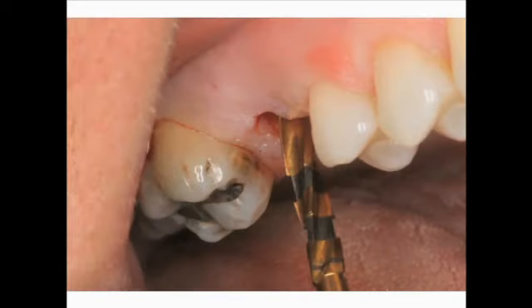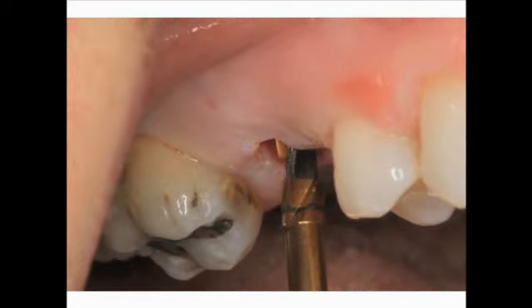Note again that the soft tissue was almost 3 millimeters in height, so in determining a visual on how deep to place the implant, the 9 millimeters we want the implant to go into the bone is added to the 3 millimeters of tissue height. Therefore, the line markings on the twist drill are visualized to about 12 millimeters. Thus, the visual is in between the second large black line, which is about 12 millimeters.